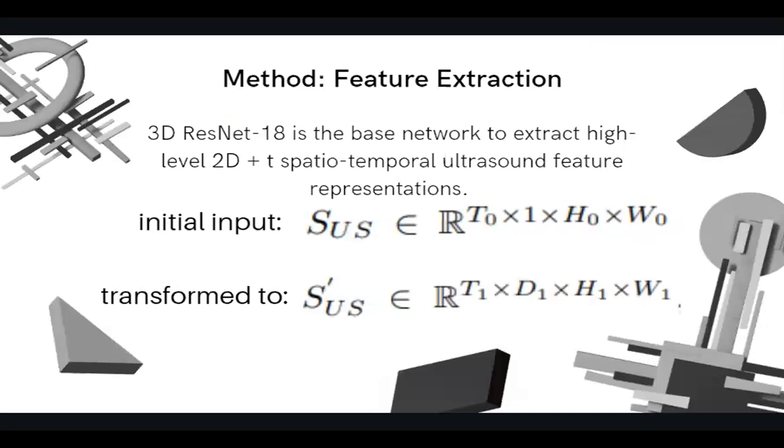It's transformed via convolutional residual modules to a low resolution feature map, where T is the original frame number divided by 4, H is the original height divided by 8, and width is the original width divided by 8. These feature maps are fed into the residual transformer module that we'll be talking about next.